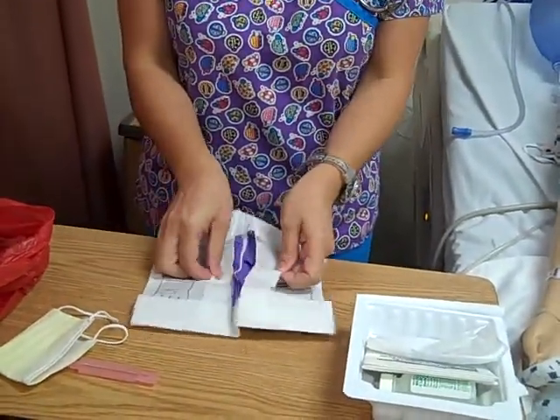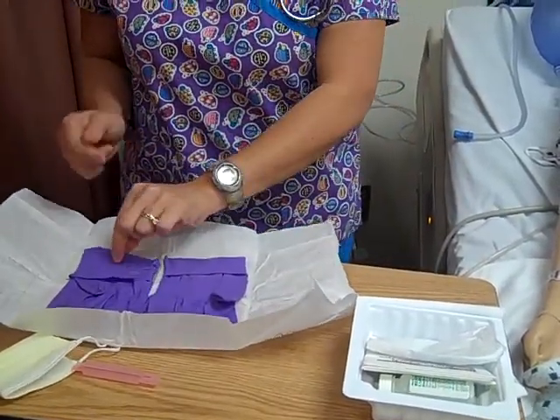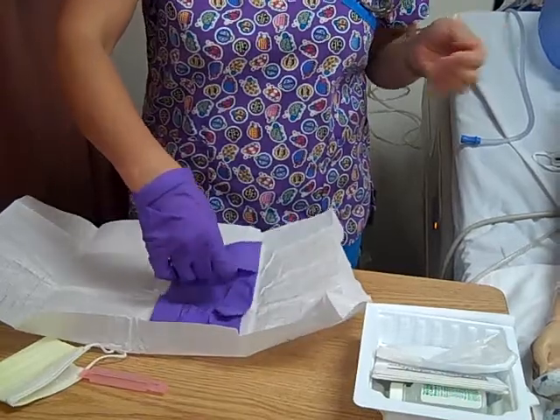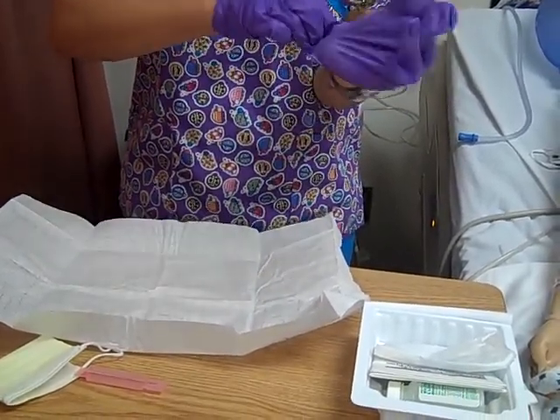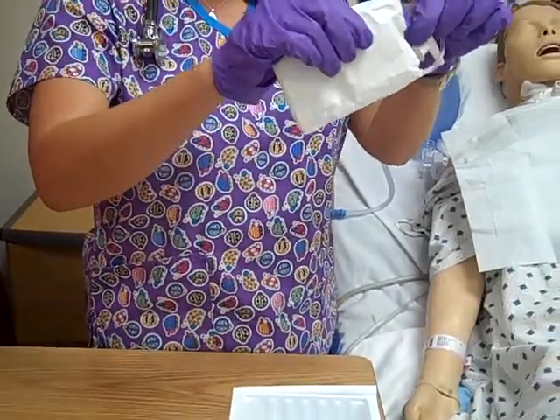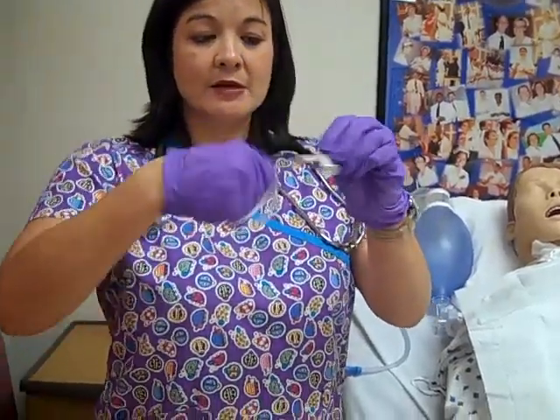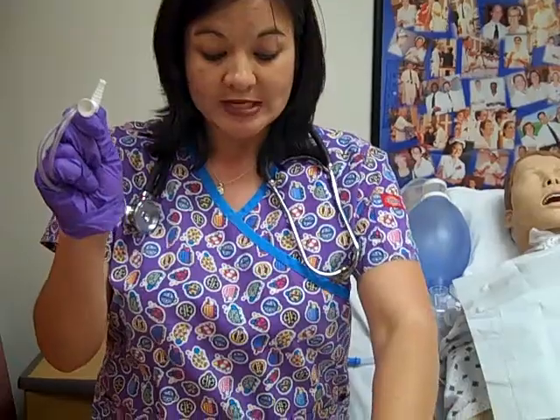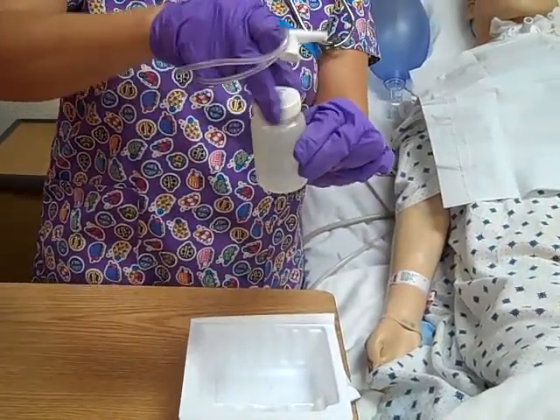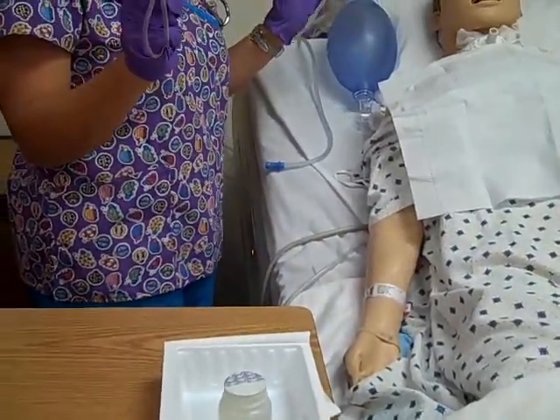Open up my sterile gloves. I would have washed my hands again in between taking off my old gloves and putting on my new ones. Notice that I'm taking that out keeping it sterile. I'm going to wrap this end in my dominant hand, leaving the tip exposed. I'm going to go ahead and take out my sterile water, undo it, and set it in the tray. Now I am ready to begin suctioning.